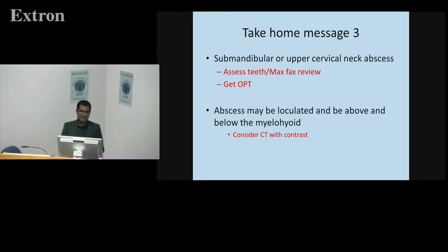So, take home message again. If submandibular abscess, think teeth. Max fax review. Get an OPT, or let them decide what they want to get.